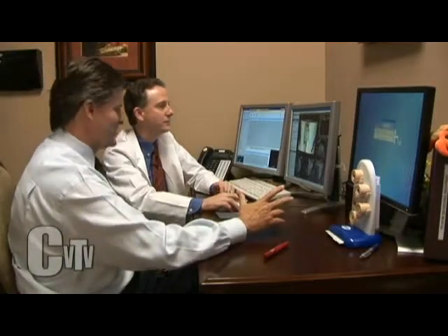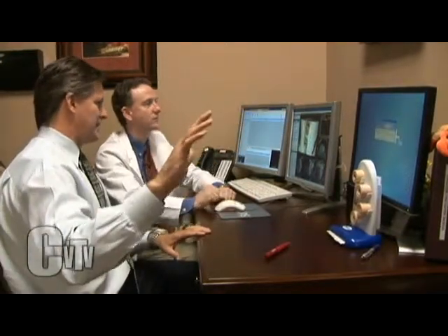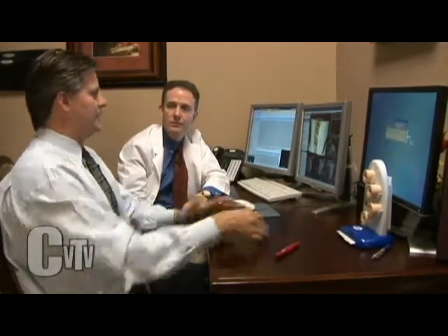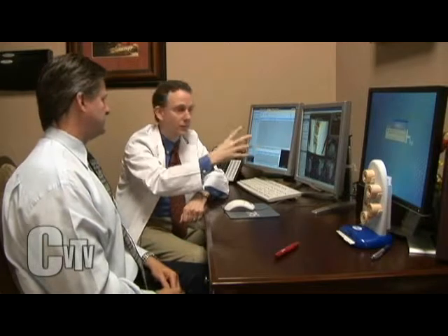So when you tell somebody that your scan is normal, you've gone through a lot of things for them, haven't you? When it's normal, it is buck stops here, do not pass go, normal. The process for state-of-the-art cardiology is a patient comes in, usually takes some pills the night before to make sure their heart's going nice and slow. They come in, get the IV, walk in, lay down, hold this, boom, boom, boom, come back out, and then we sit them down. Just like we did today, we're going to sit down with the patient right then and go through the data right here, because we can explore them three-dimensionally with this information.